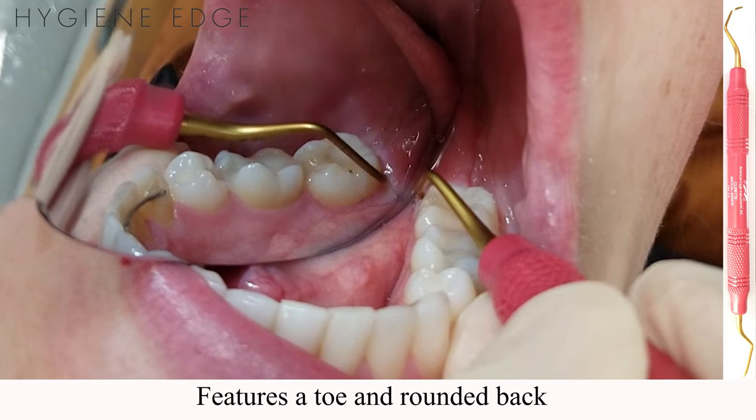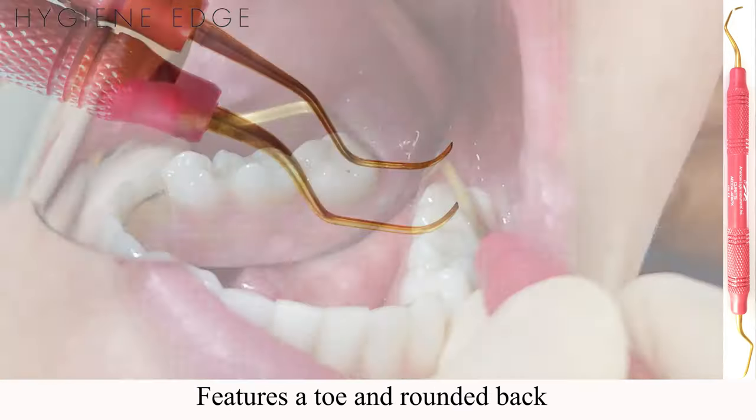It has a rounded back with a toe, a deep shank angle, and a longer shank than the similar Barnhart 5-6.